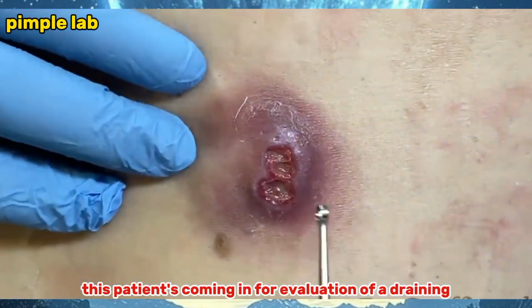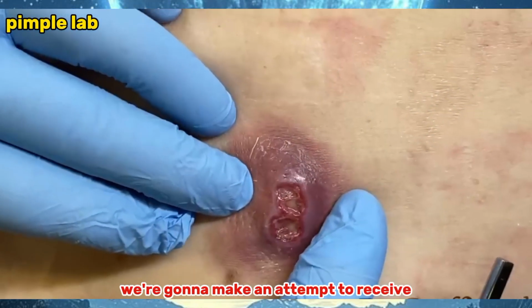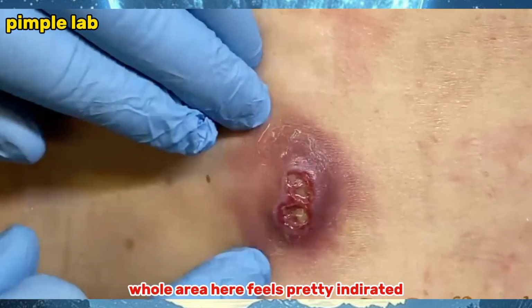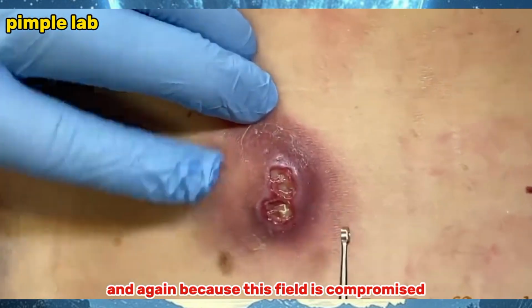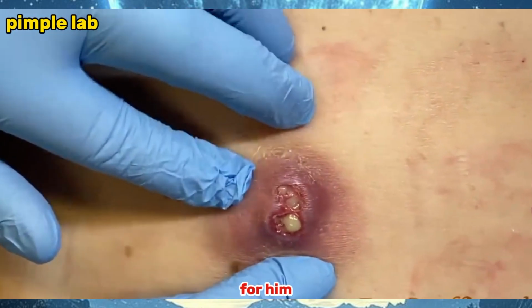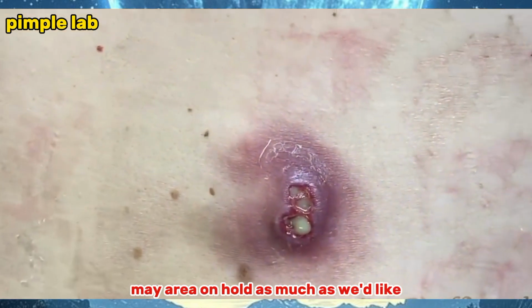So this patient's coming in for evaluation of a draining infected cyst. We're going to make an attempt to see if we can get that to drain as much as possible, and then clean that out and see what we're left with. The whole area here feels pretty indurated. And again, because this field is a bit compromised, we're going to add some freezing because we want to make this as comfortable as possible for him. And I don't want to push too much on it until we do that. But the freezing may or may not hold as much as we'd like.